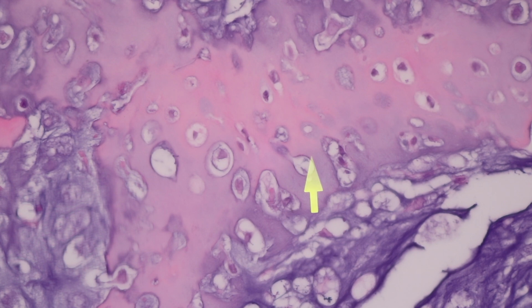Yeah, basic binding the acid. That makes perfect sense. So I agree it can be confusing, but get over it. Just remember, cartilage can be pink. Look at the lacunae. Are there canaliculi?